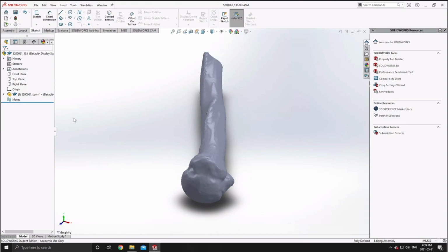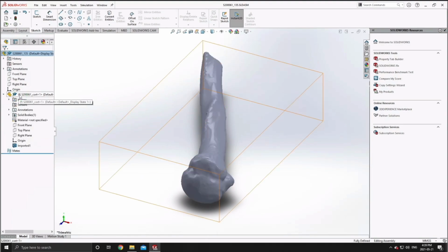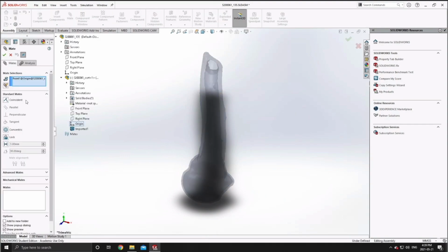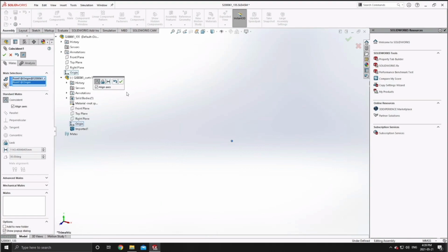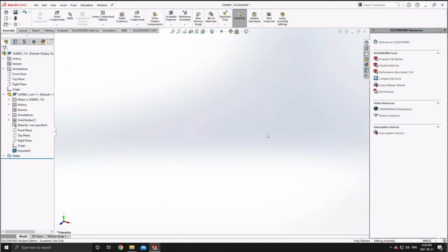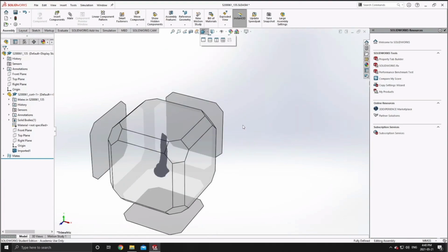So just make sure that you normalize the SolidWorks origin with the origin of your cortical or trabecular bone models. What I'm doing right here is I'm just making sure that the cortical bone model is floating, and then I'm just going to mate it with the origin, ensuring that that align axis check mark is selected.